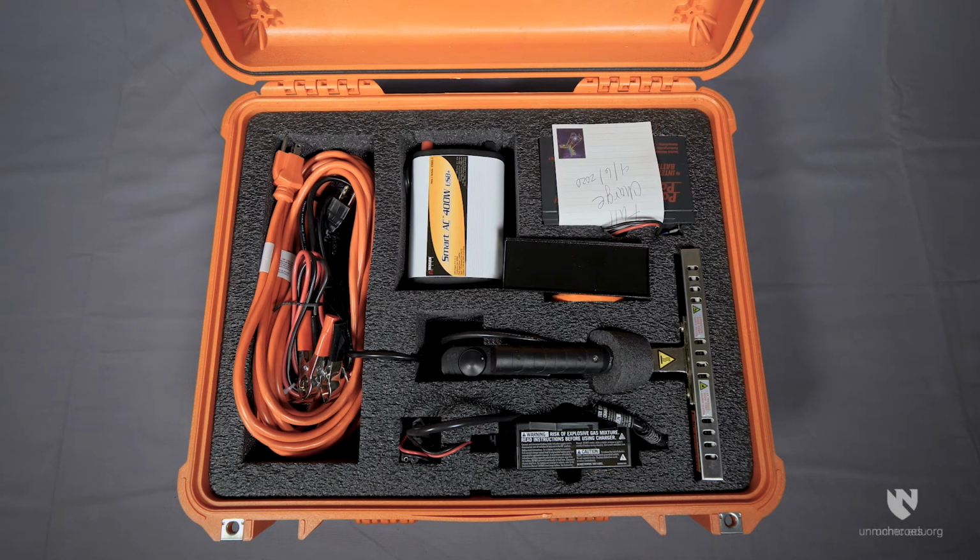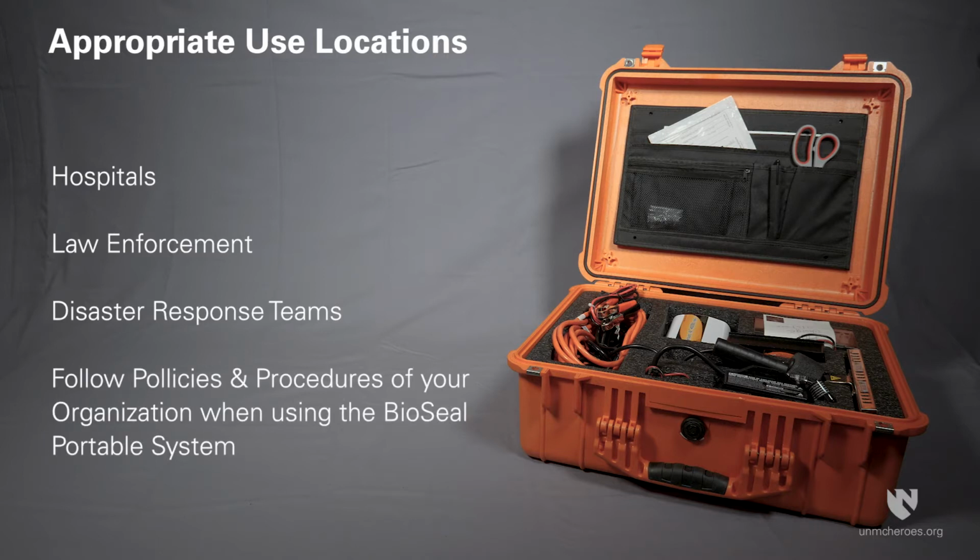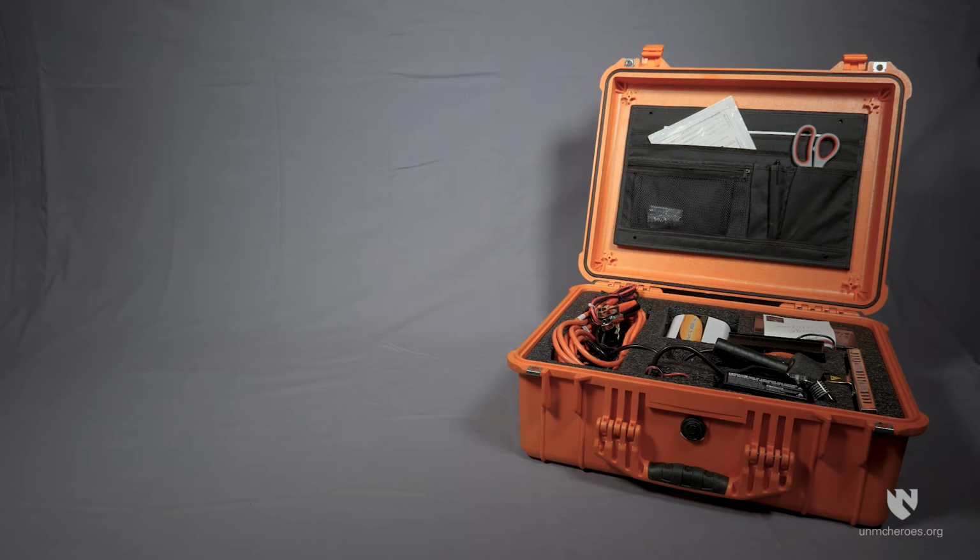bag. The portable system has its own power supply and is appropriate for use in hospitals, by law enforcement, and by disaster response teams. Please follow your organizational policies and procedures when using this system. The portable system is contained in a lightweight, rugged carrying case.